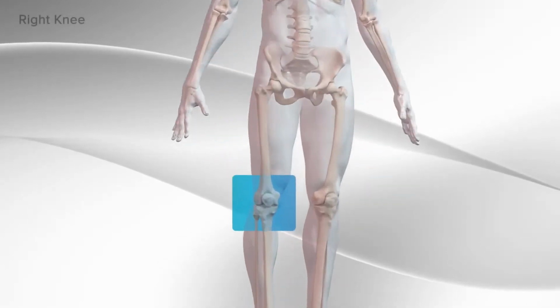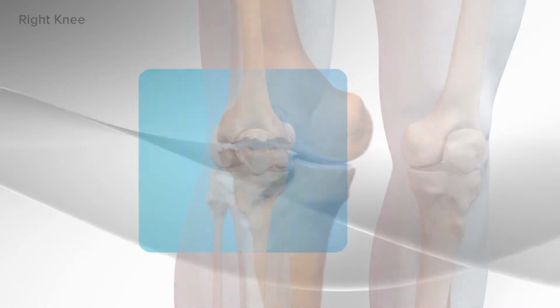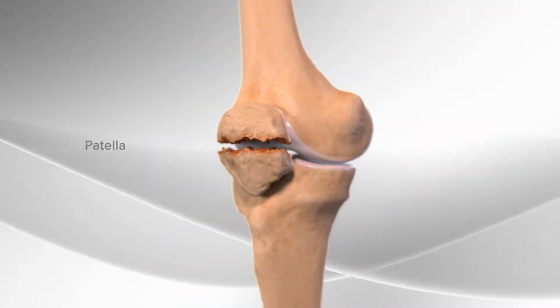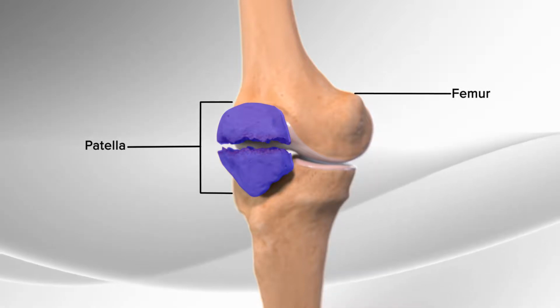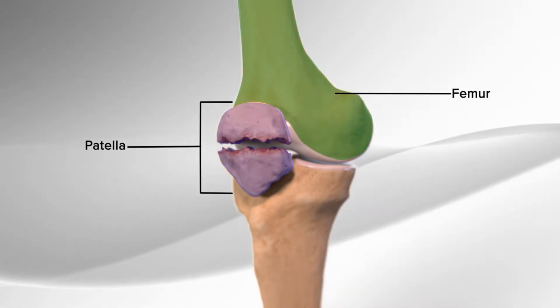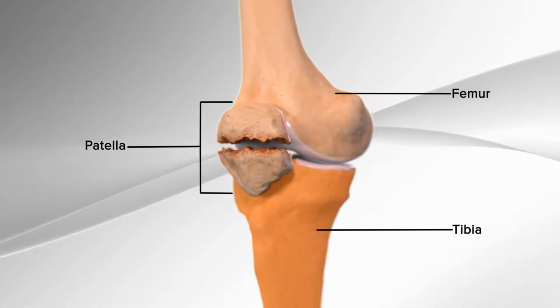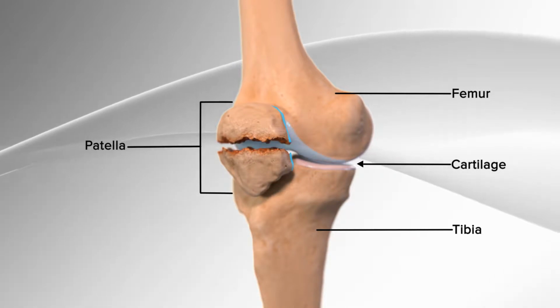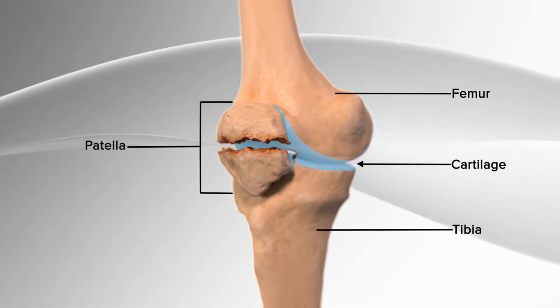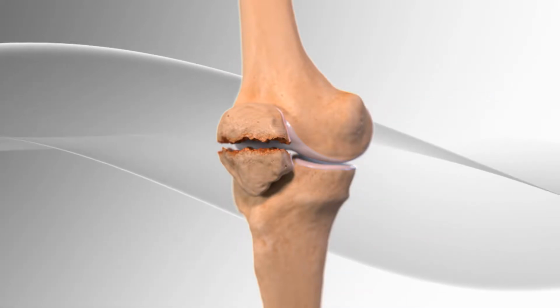In this video, we'll demonstrate the repair of the broken patella in the knee using a surgical set designed to fix it. The patella is a small floating bone that glides over the femur or thigh bone. It connects the muscles of the thigh to the tibia or the shin bone, helping the knee to move. The cartilage or the eggshell-type covering on the underside of the patella and front of the femur allows for smooth motion of the knee. The patella can break due to trauma.